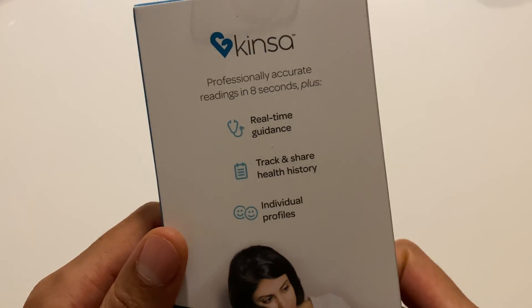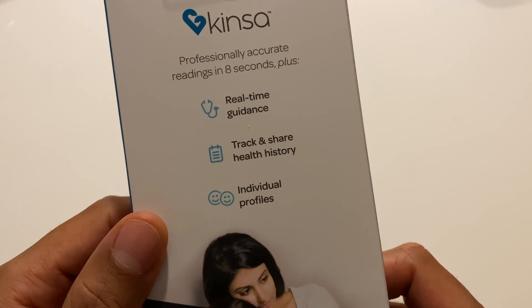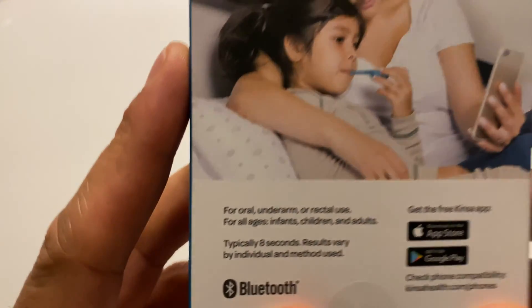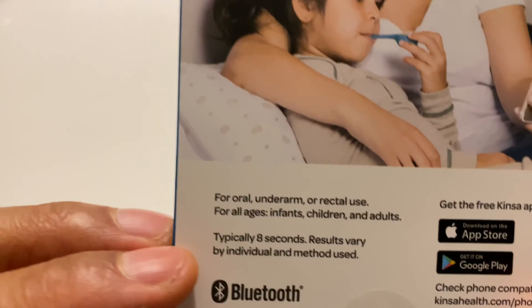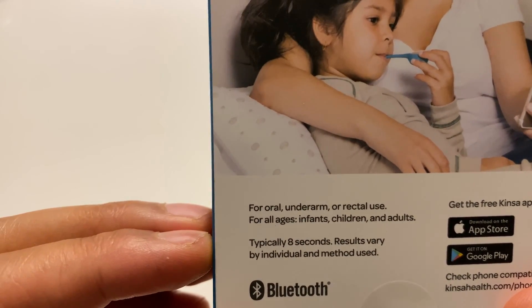It's a Kinsa. Let's read what it says on the back. It says: real-time guidance, track and share health history, and individual profiles. So you can have individual profiles for multiple people. That's pretty good, and I think that's pretty much standard that you have multi-profiles. It says for oral, underarm, or rectal use — you have options.